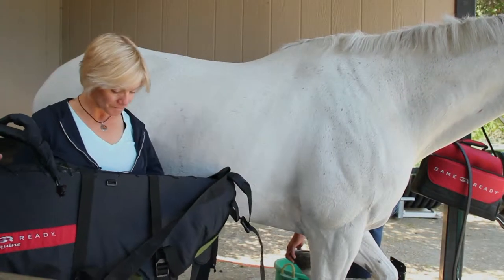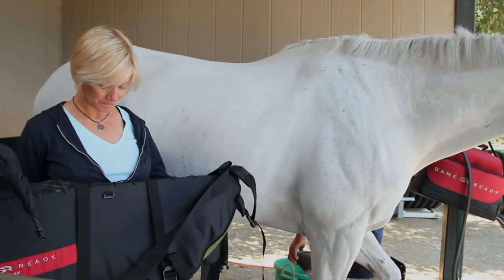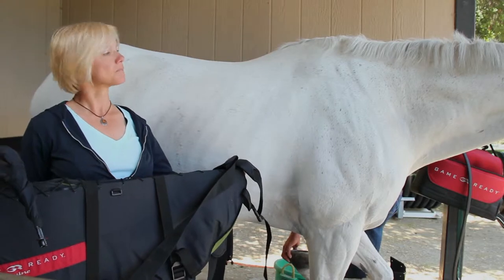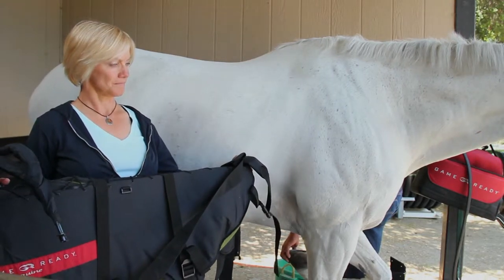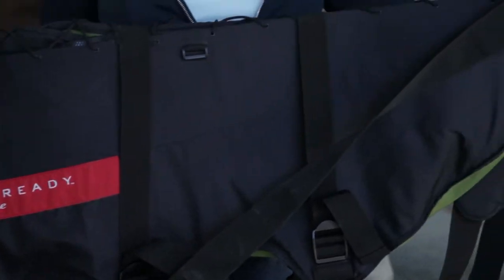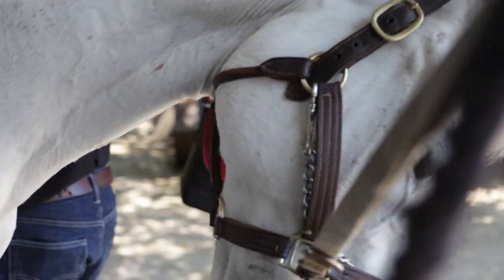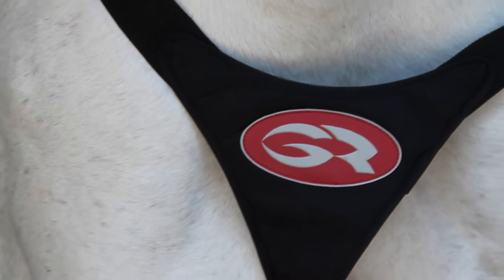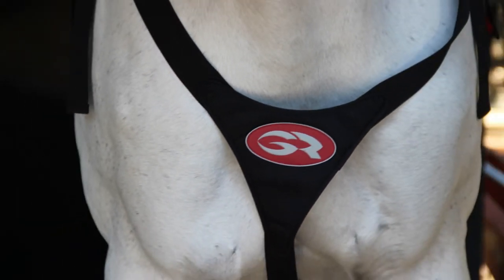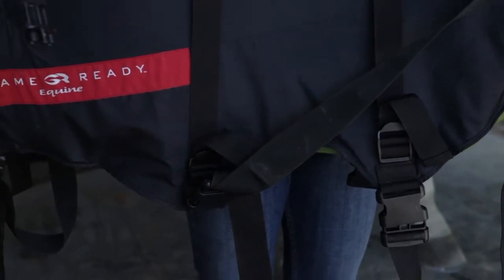The wrap is comprised of an inner two-chamber heat exchanger and outer sleeve that facilitates the delivery of active compression and cooling to the injury or surgery site. The Equine Backwrap has a unique design with plenty of adjustment points to help fit a variety of sizes and shapes of horses. A breastplate-inspired design allows for fitting over the withers and around the shoulders, while surcingle straps around the horse's barrel accommodate a wide range of breeds.